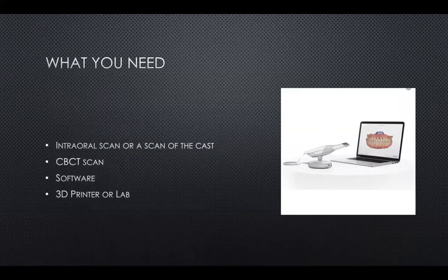So what do we need? We need an intraoral scan, and I know that the scanners are expensive, and the majority of the dentists don't have the luxury of owning a scanner in their offices. So what we can do is take a regular impression, an alginate impression, pour it, and then send it to a lab who have a scanner, and the lab can scan this cast for you.